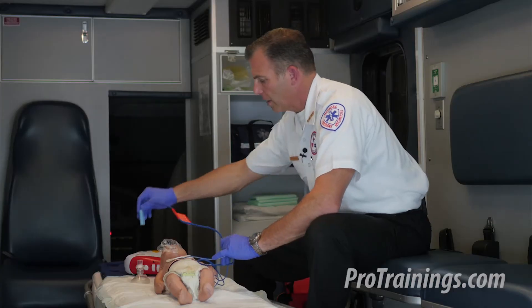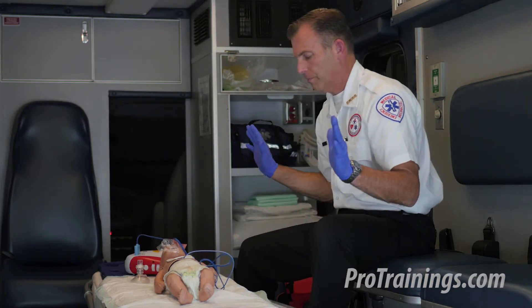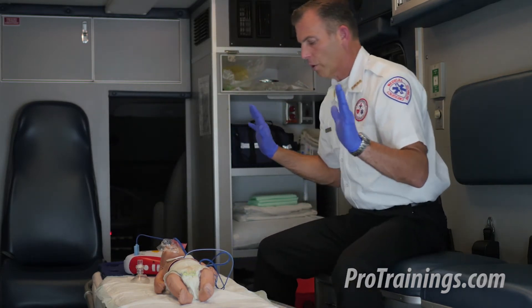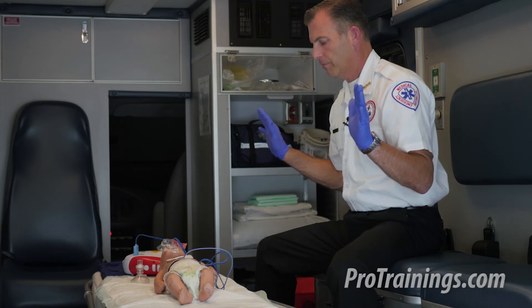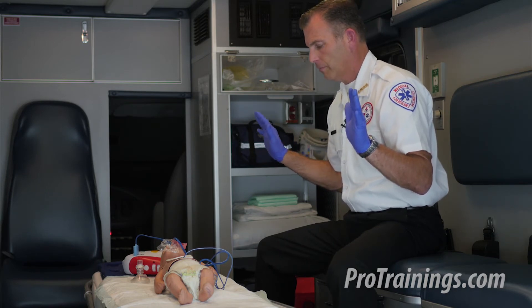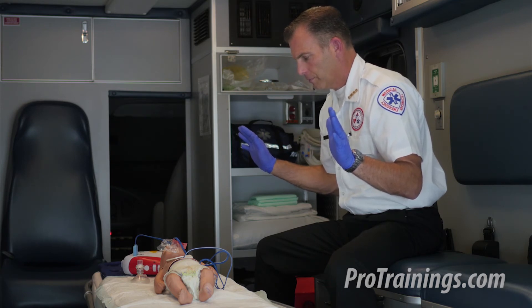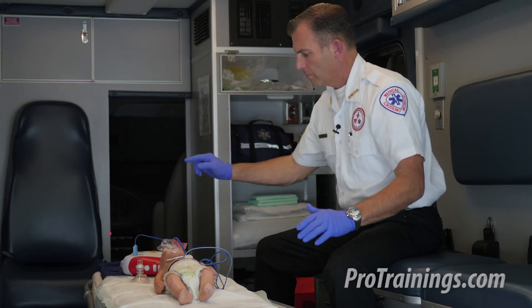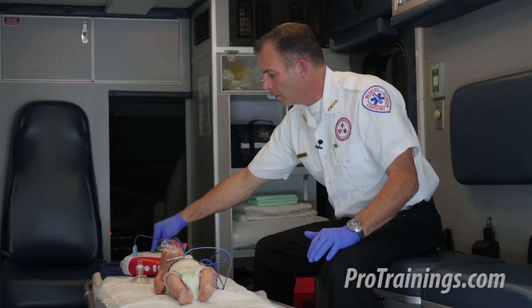Check connector and pads — I'm going to plug in my connector. The AED is now analyzing the rhythm. Everyone stand clear — we stand clear and do not touch the patient. Shock advised. Charging. Everyone stand clear. I'm being prompted to push the flashing yellow button.